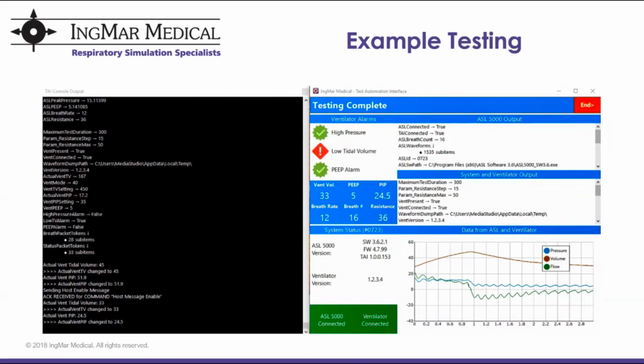Right, so same command with the SA command. When you type SA, it asks for what the ID is. If you set the ID to a specific ASL, you will be commanding only that ASL. However, we have the option where you can set the SA command to 0000, I believe, and that will then control all the ASLs at the same time. So if you're running multiple verifications against devices and you want the ASLs to repeat the same way, this is how you would be able to run that.